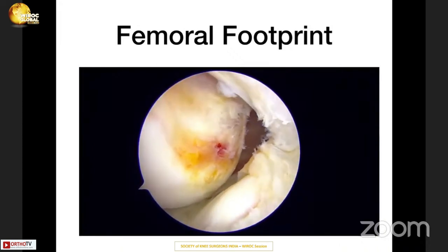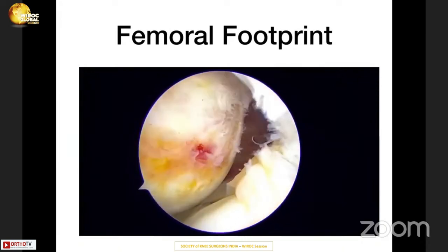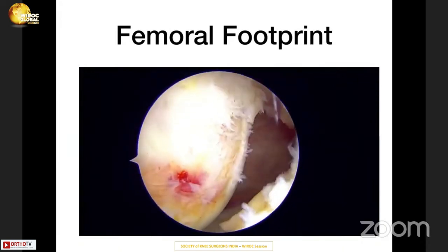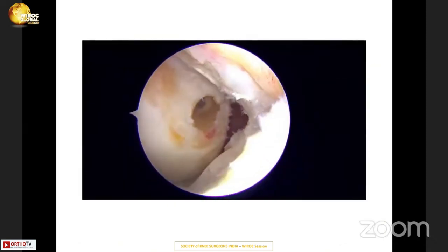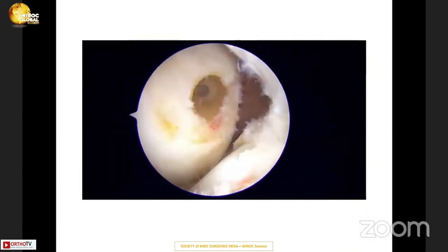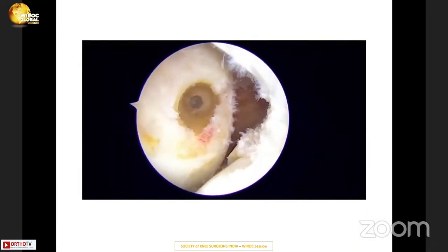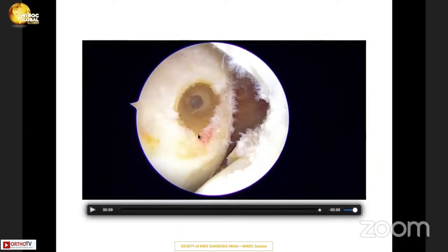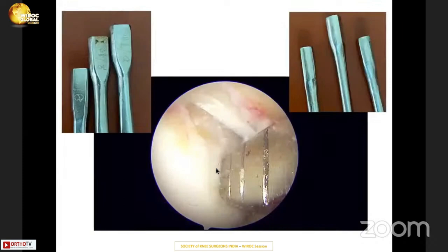When we do arthroscopy, we know the femoral footprint is not circular — it's always oval-shaped, with the superior-inferior dimension greater than the anteroposterior. This is what we typically use for our anatomical single bundle ACL tunnel position, which is quite acceptable with no posterior blowout and a good circular tunnel. But we are yet to address the position where the posterolateral bundle attaches. These are special tunnel dilators prepared with our local vendors — rectangular in shape, available in various sizes: 8×8.5, 8×9 mm, 8×9.5, 8×10, and so on.